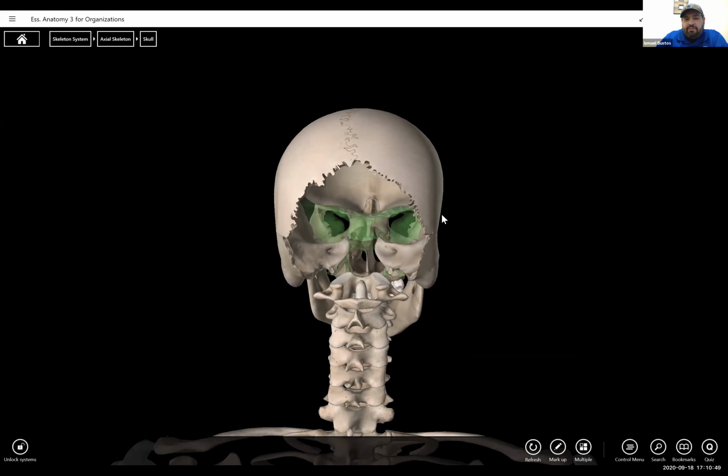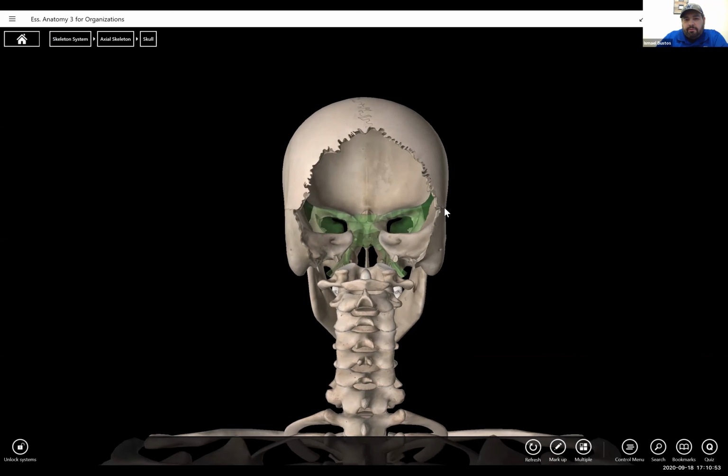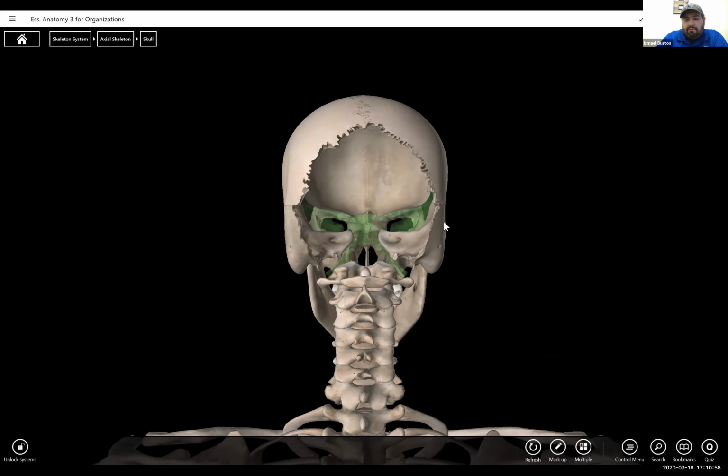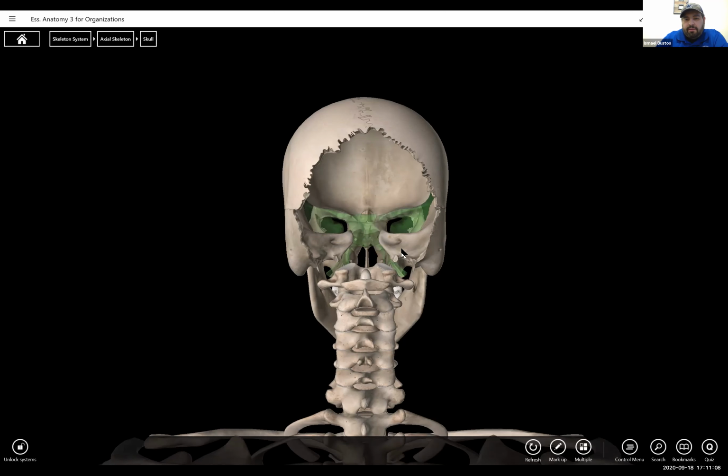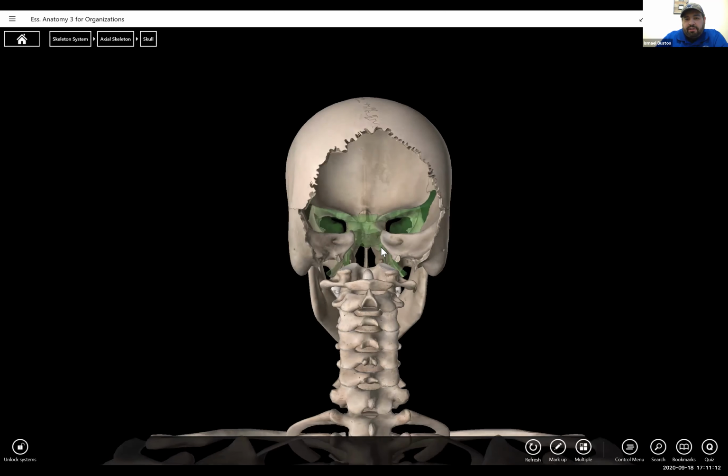So my patient has their nose and forehead on the image receptor. If you have your nose and forehead on the image receptor, you will see that the ridges, which are these structures here, are in the lower 1/3 of the orbit. Everybody see the orbits here, the holes that are there? If we're in a correctly positioned Caldwell, that's what you will see. You will see those ridges in the lower 1/3 of the orbit.